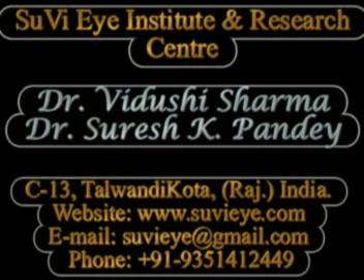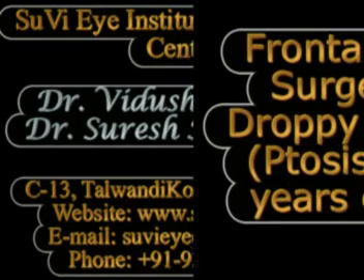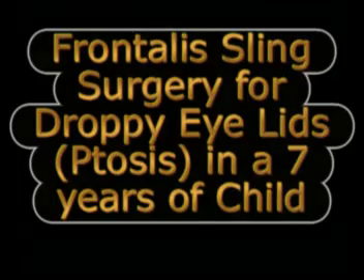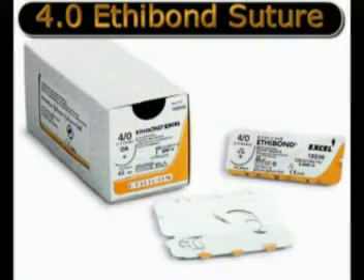Hi, I am Dr. Vidushi from Suvi Eye Hospital, Kota in India, and in this video we demonstrate the technique of performing a frontalis sling surgery for bilateral severe blepharoptosis using a non-absorbable suture material, specifically 4-0 ethibond in this case.